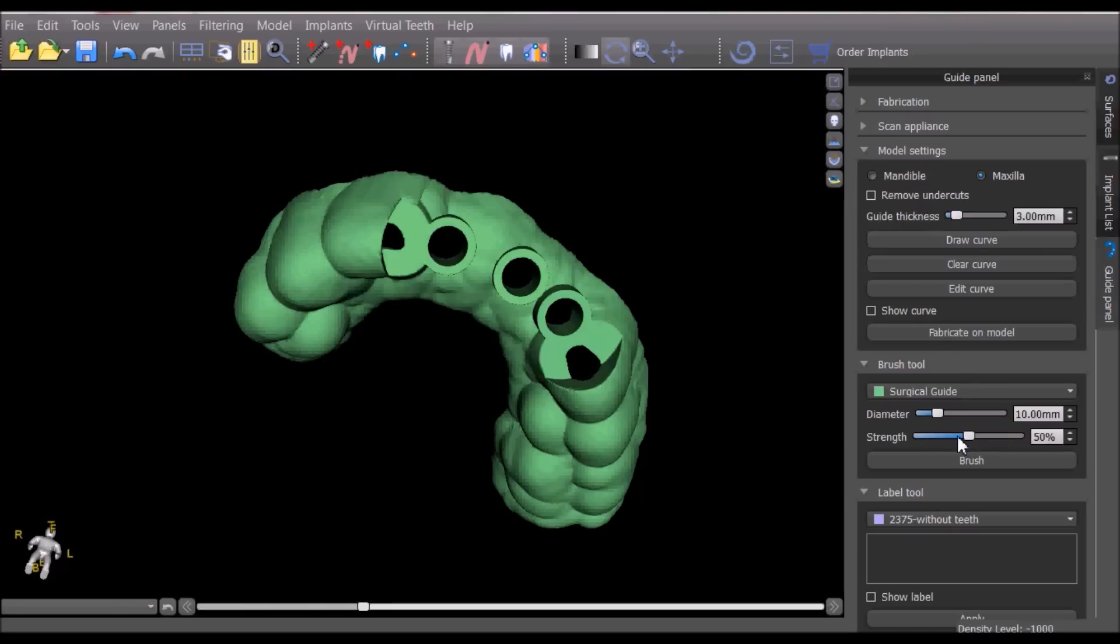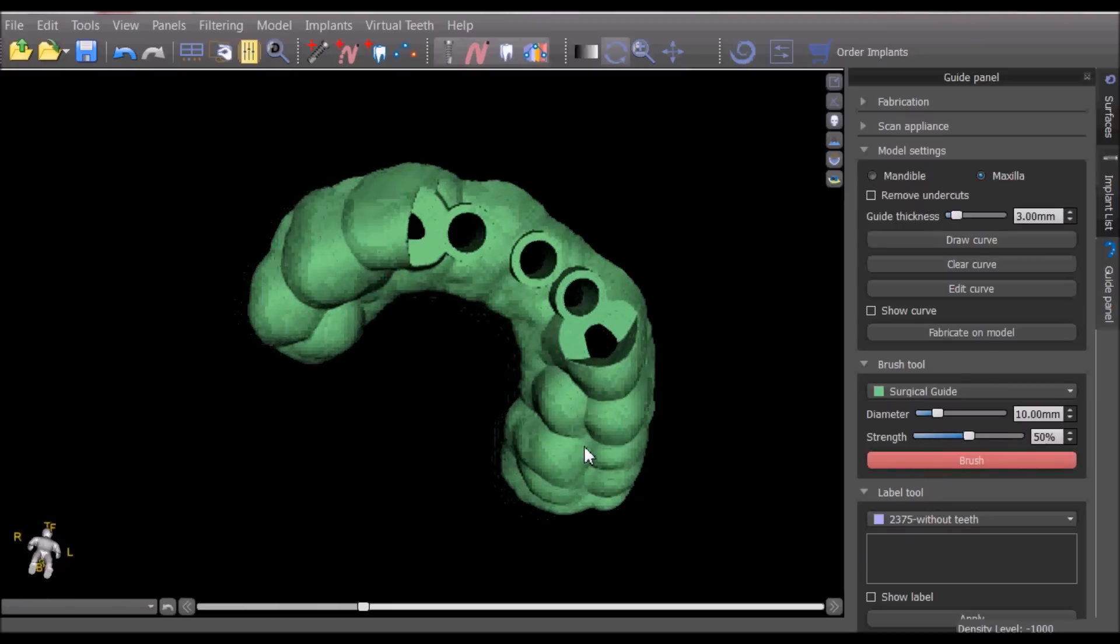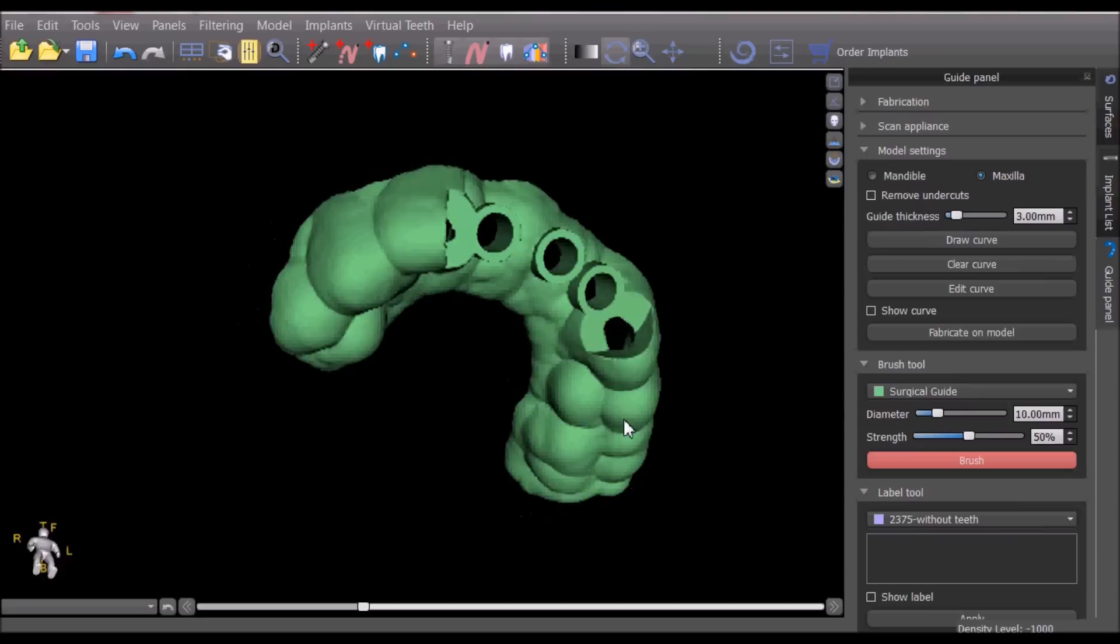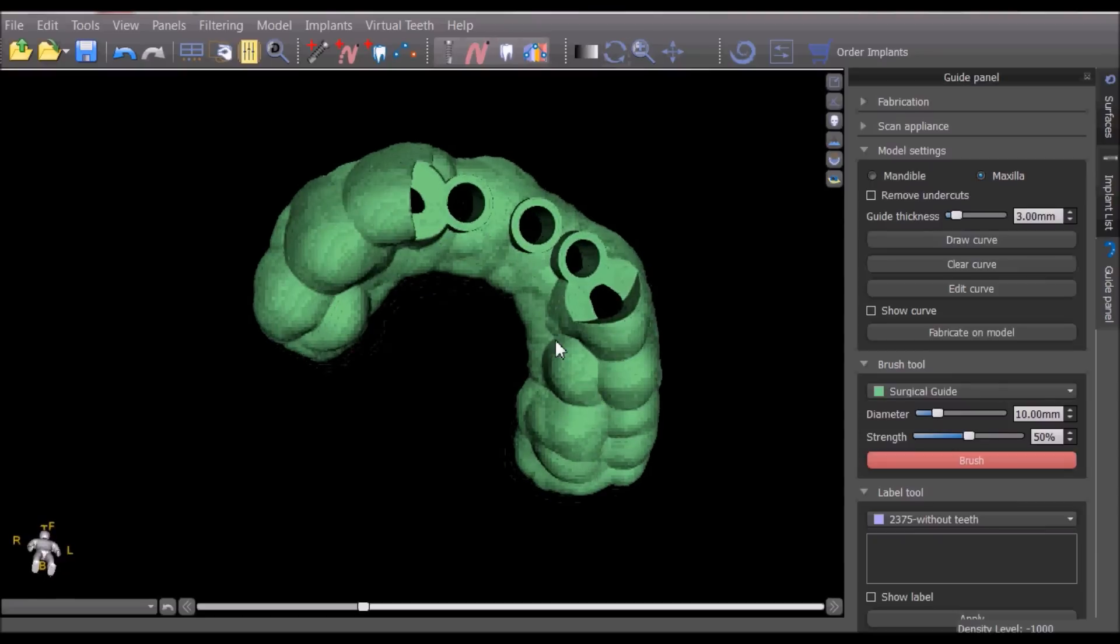The brush tool can be used to smooth out areas on the surgical guide by holding down the shift key and using the left mouse button to do the smoothing.